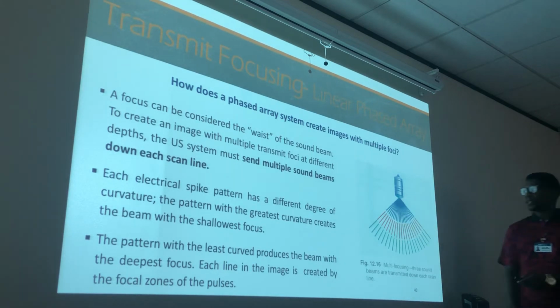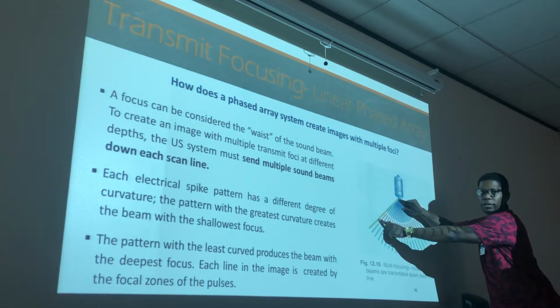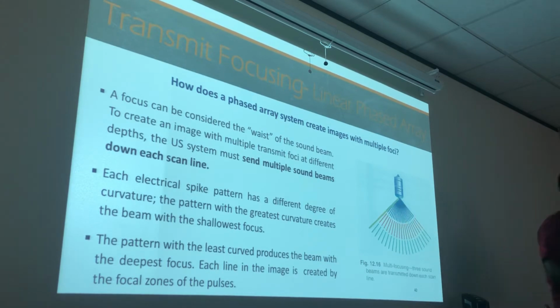Even though the last one has to travel all the way through, it's not going to take that information. It's only going to take the deep information, because we already have the other focuses covering the shallow and intermediate depths. So even though it travels the whole scan line, it's only taking the deeper information. This is 3 focuses. However many focuses you have, that's how many times you're going to travel down that same scan line.